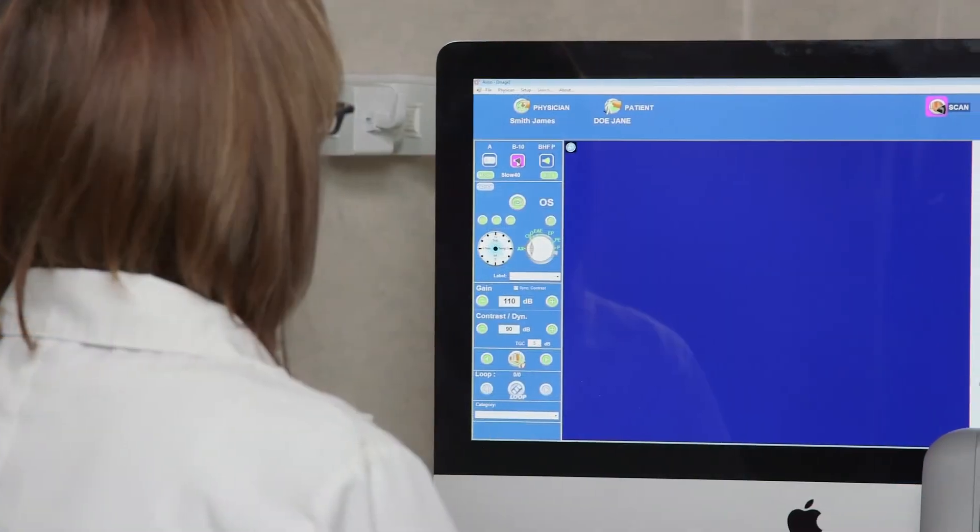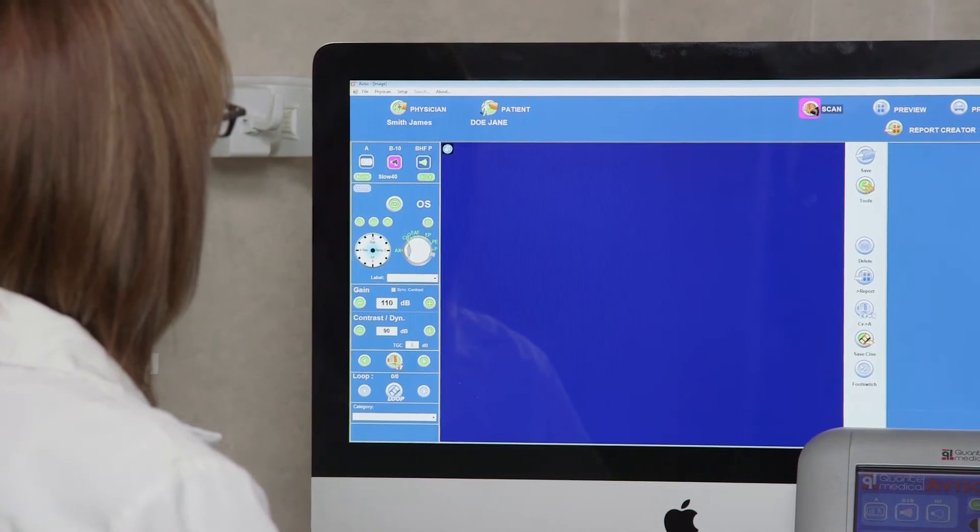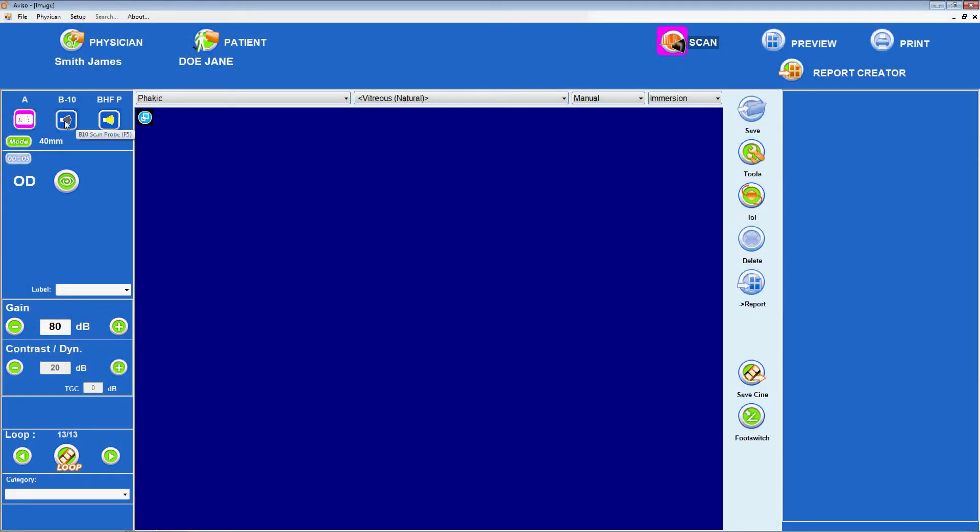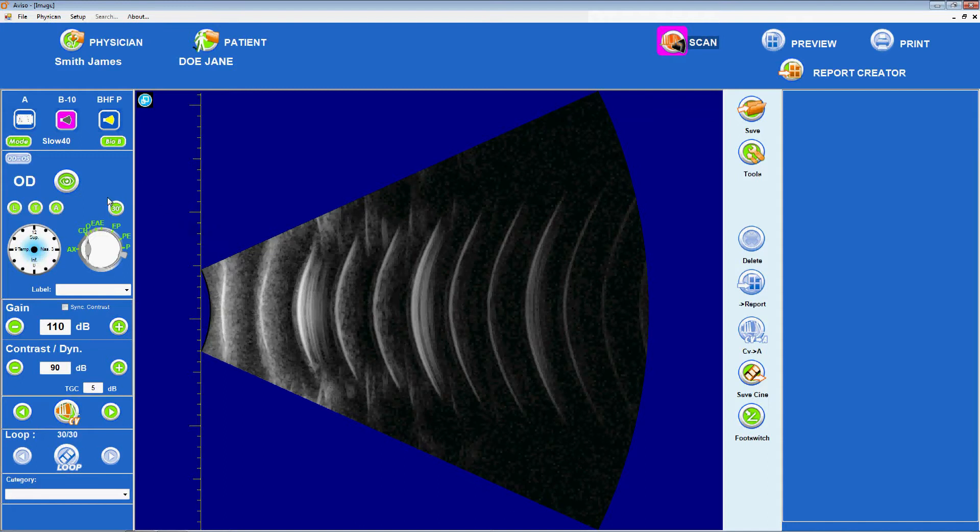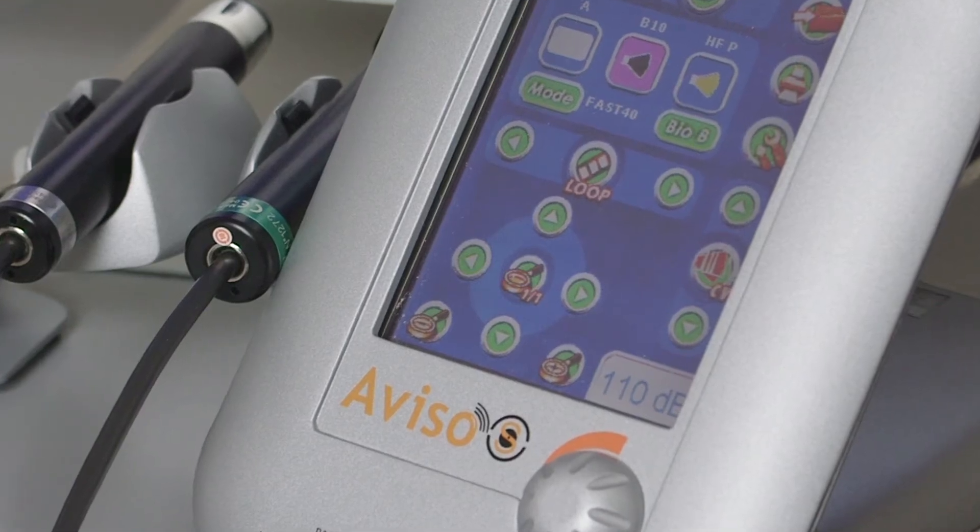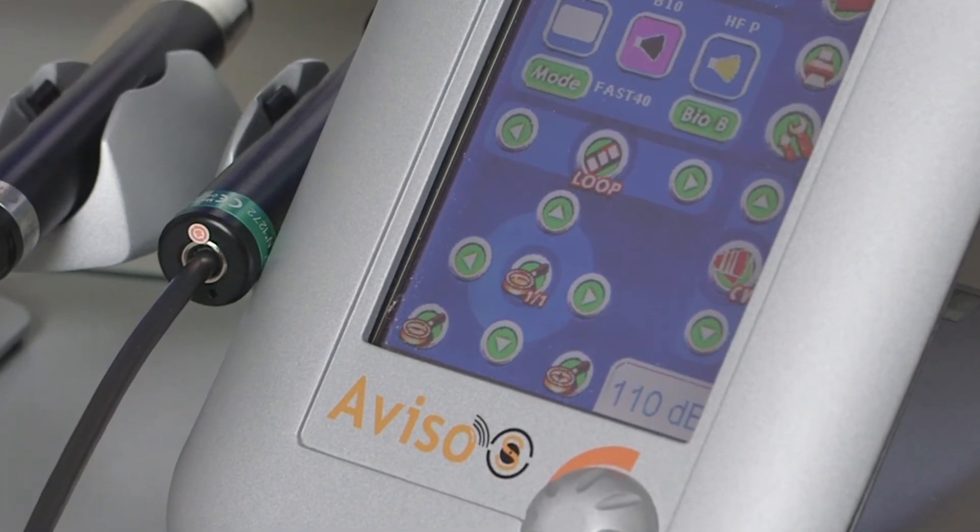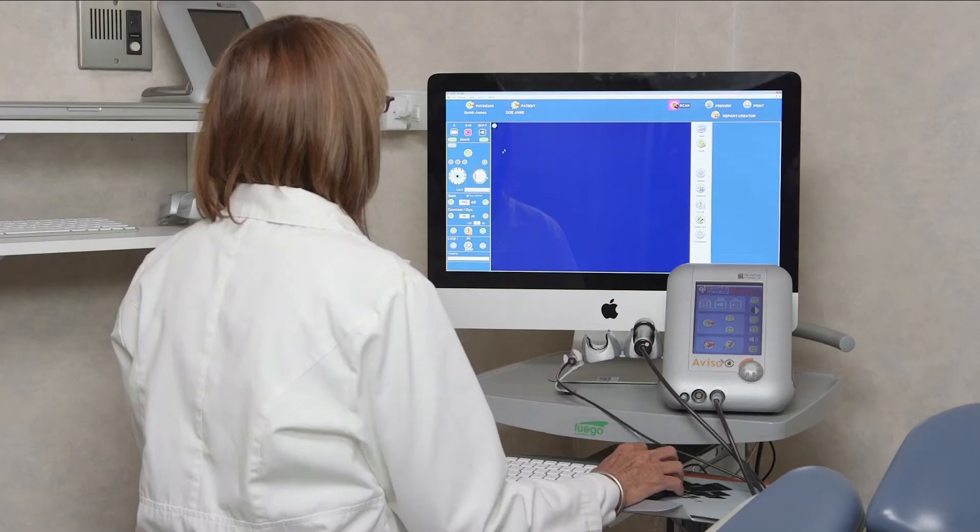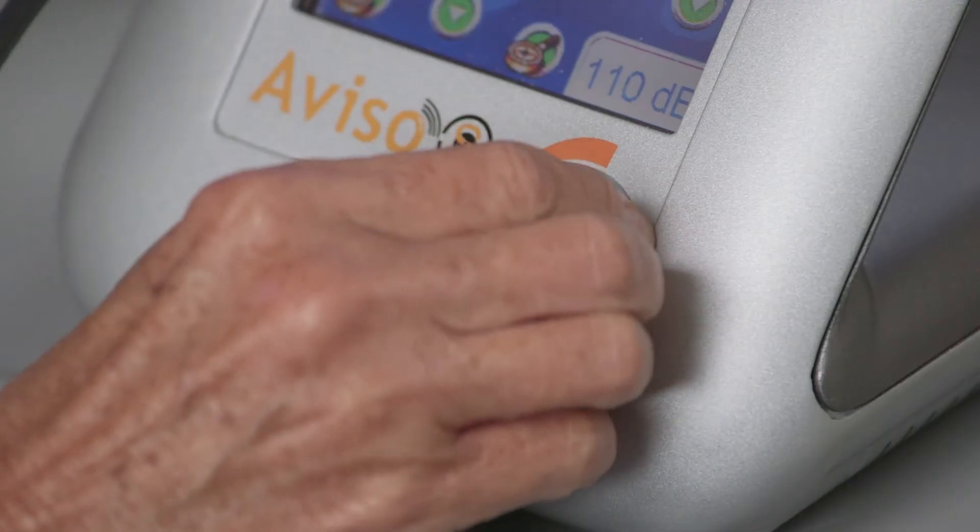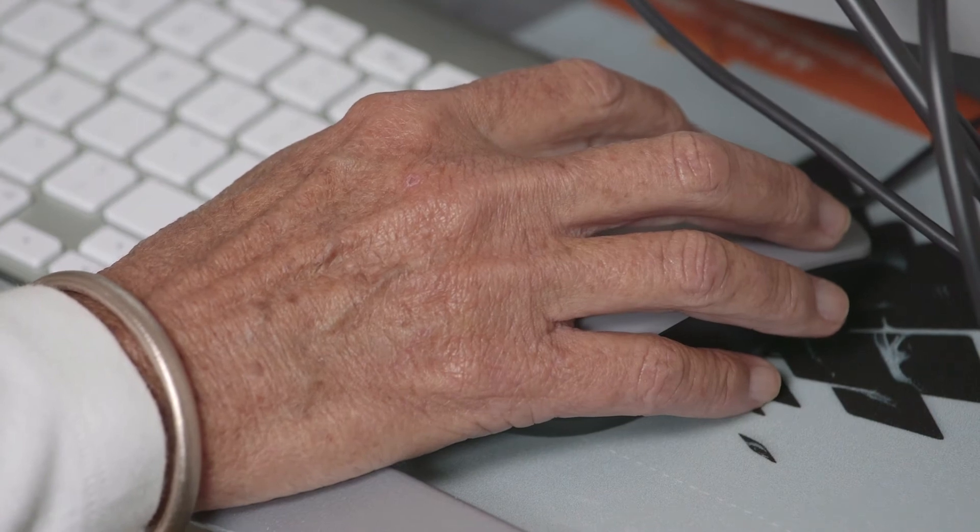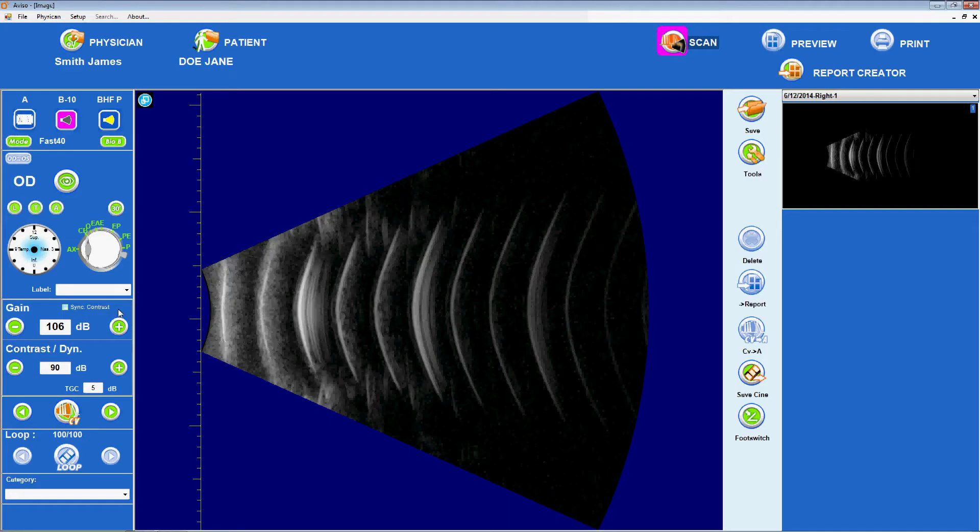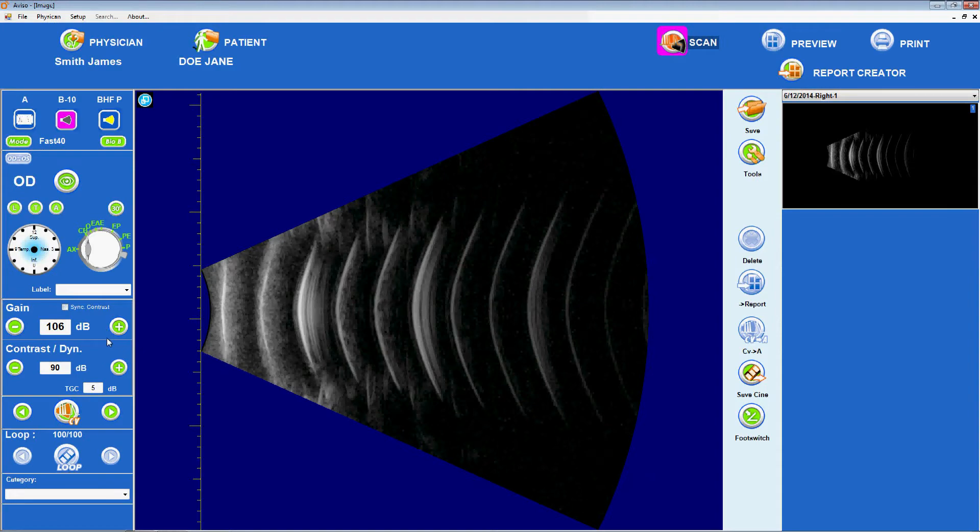Selecting the B10 icon on the touch screen opens up B mode and indicates that the 10 MHz B scan probe will be used. The depth displayed, 40 mm or 60 mm, can be selected once again using the green mode button on the touch screen or the left-hand menu on the computer screen. Once the scan is in progress, the vertical and horizontal arrows on the touch screen can move the position of the image on the acquisition screen and the plus and minus magnifying glass icons zoom in and out. In B mode, the gain can be adjusted either using the grey knob on the Aviso-S device or using the mouse to interact with the gain field on the left-hand side of the image acquisition screen. Selecting the SynchroDyn checkbox ensures that the dynamic, contrast, changes in tandem with gain to optimize image quality.